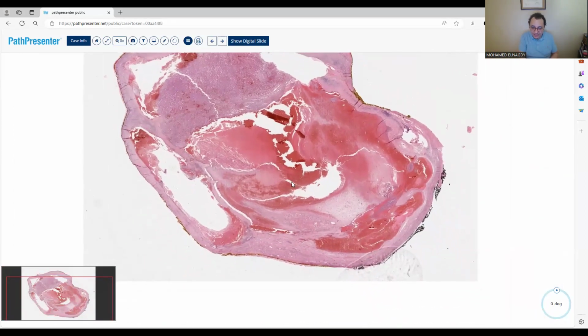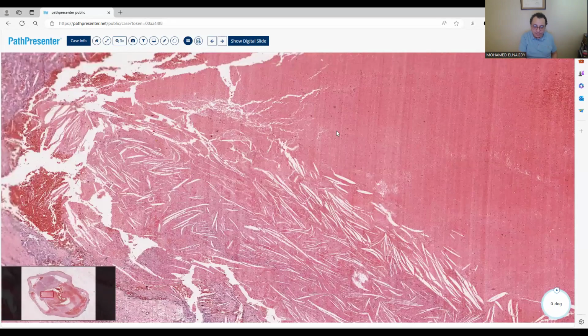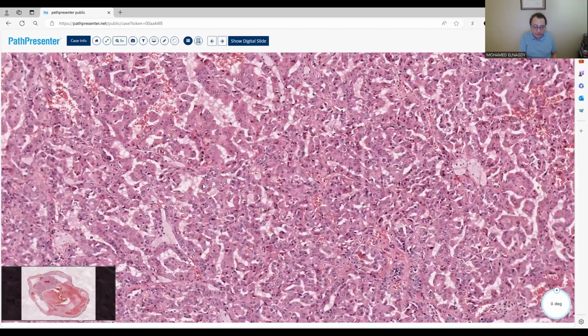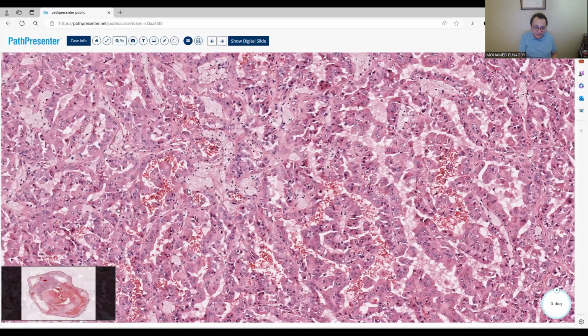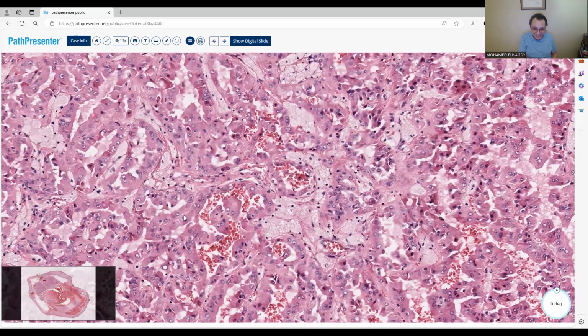So this is the renal mass. As you can see here, we're seeing some areas of crystals, some hemorrhage, necrosis, and then here we go. This is the area where the action is going on. Looks like small tubules here. Oh yeah, small tubules, and then some clear cells. Makes sense. Is there anything catchy here? I don't know if this is mucus. No, don't confuse yourself, it's not mucus. Okay, so I see papillary structures. Okay, starting to get there.